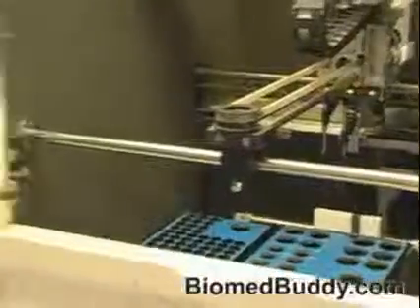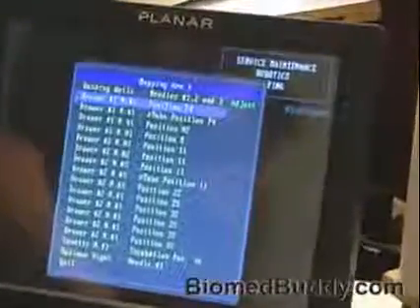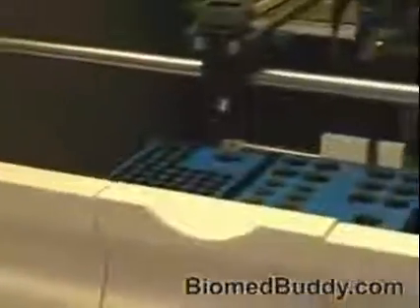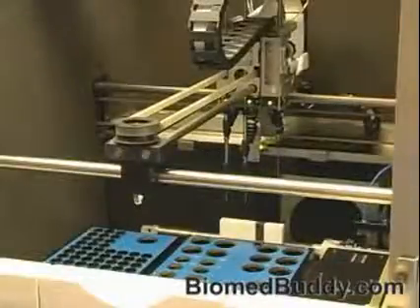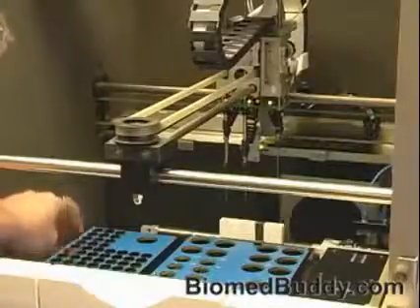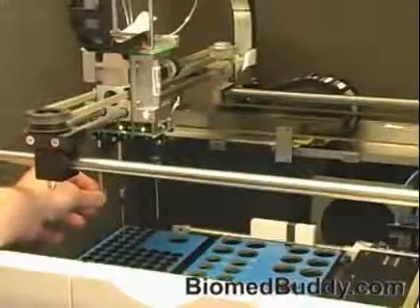And now we're going to go down to F4. F4 is in drawer number 1, and it's not really that critical. But we're going to hit F4 anyway, just to do it, and we hit F2 to make the adjustment. By the way, one of the tips on the STA Compact is to read the screen. Just read it. Put a tube in F4, make sure it's all the way down to the bottom. F10 to validate. I'm just reading the screen. Okay, this should be in the center now.